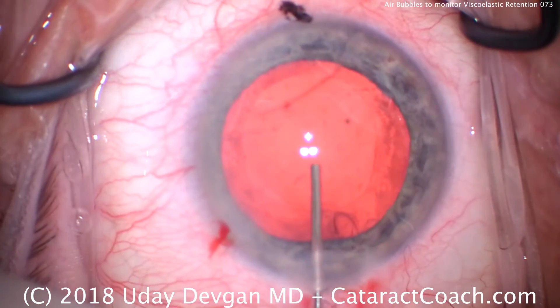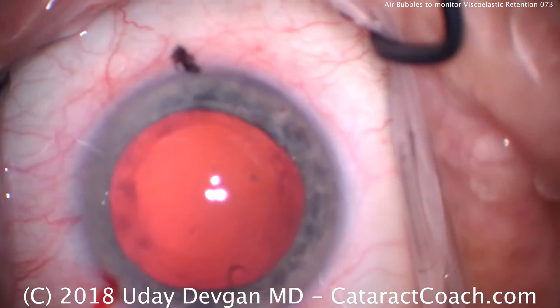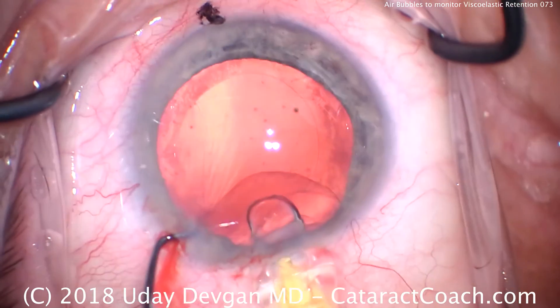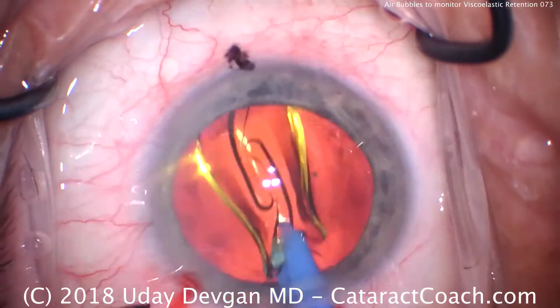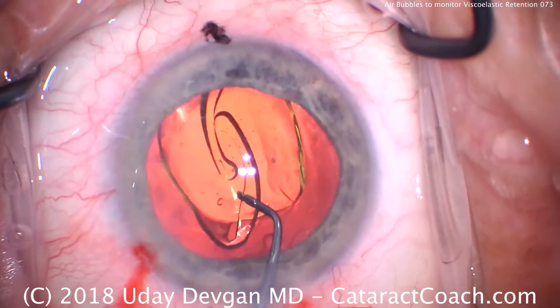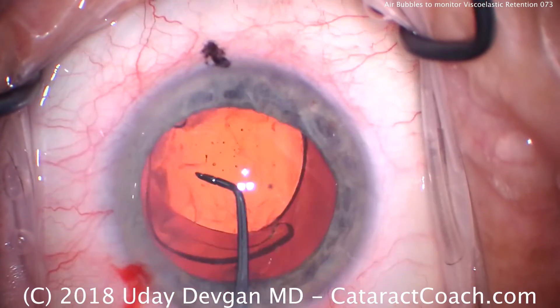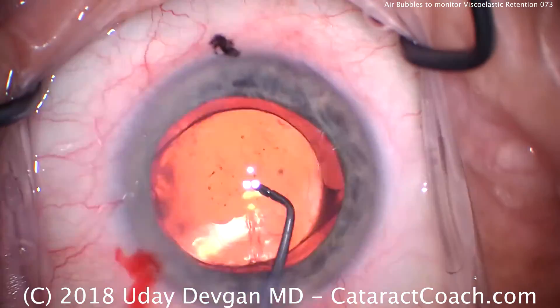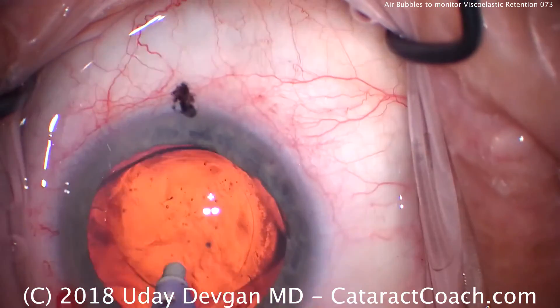There's the cohesive viscoelastic coming in. Look — we still have bubbles on the undersurface of the cornea, and that tells me we've maintained the viscoelastic in the eye. See the bubbles there — tiny little dots. Now putting the IOL into the capsular bag first and rotating it around; that'll help loosen up the subincisional cortex. There's still a tiny piece of subincisional cortex we want to remove. We can use the haptic to push on that cortex as we rotate the lens to free it up. Those dots you see in the center are the original air bubbles.